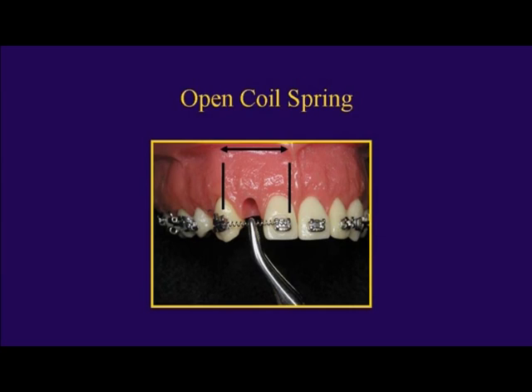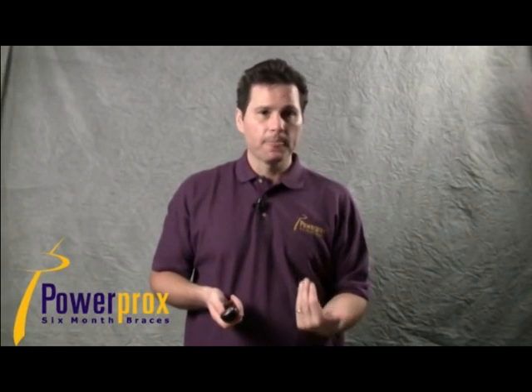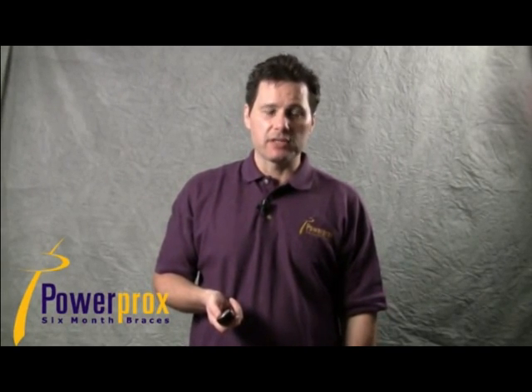You don't even bracket the tooth until you make space for it — there's no purpose in going after it if there's no room. The tooth will not move if there is no room, and all you're going to do is set yourself up for a lot of undesired side effects. Make space first.